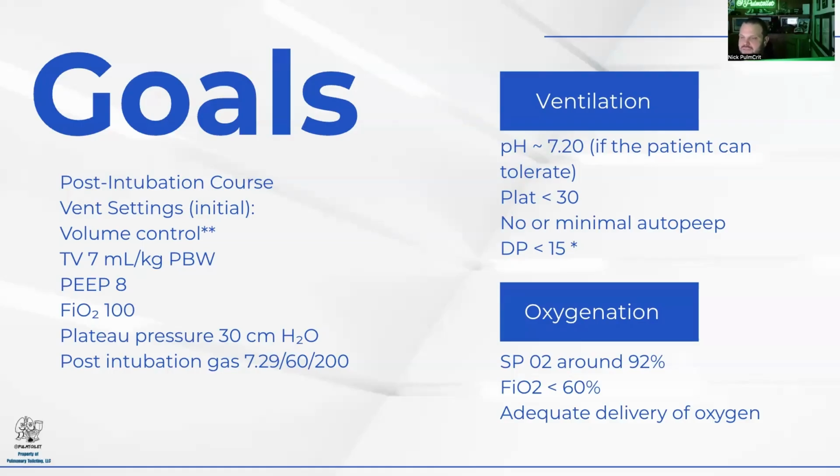You might not have a volume control option because a lot of the T1, and Melody isn't here, unfortunately. She's on vacation somewhere, which is nice. She's in like the Dominican Republic, which I'm jealous of. But you might not have access to true volume control.